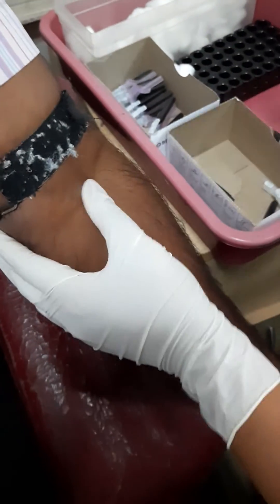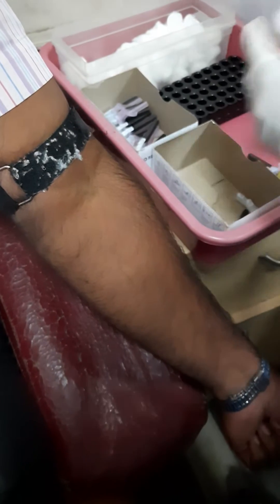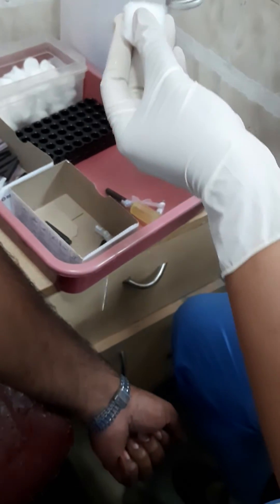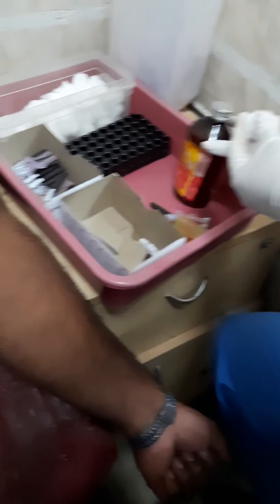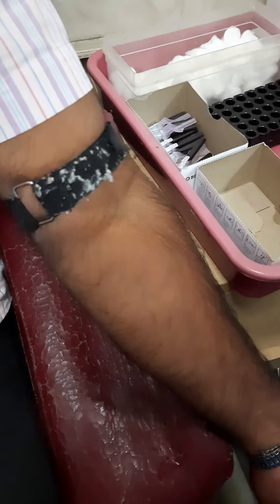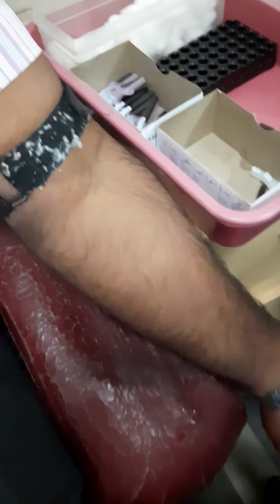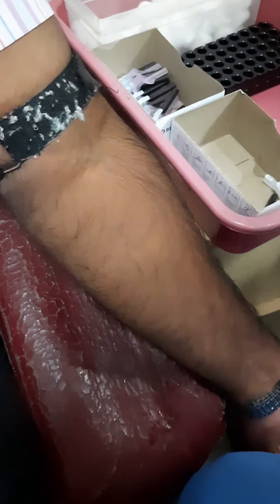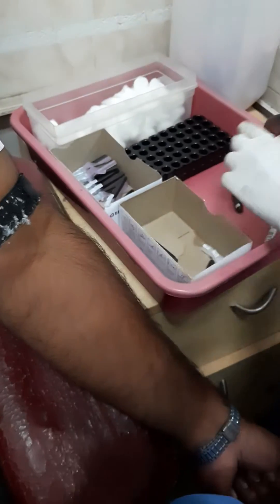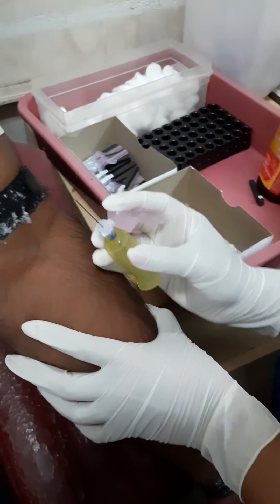Once we get it, we will take the cotton with spirit and swipe it one time. Then we will take the fixer and the vacutainer and we are going to put it.